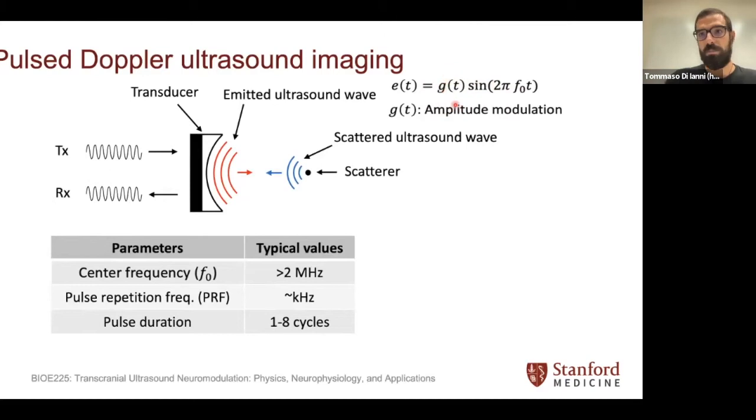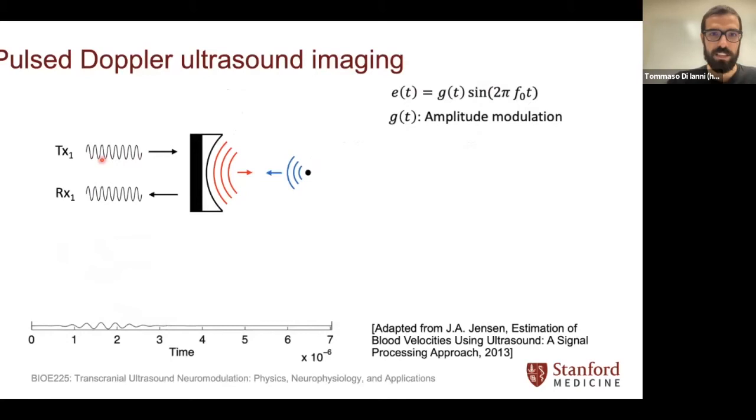And so we use this amplitude modulation factor. In our simple example here, we have just the pulse without modulation, it's a rect function, right? So we're just literally chopping the sinusoid. But it can be a ramp function, it can be a Hamming window, Tukey window, whatever we like for our application. Very cool.